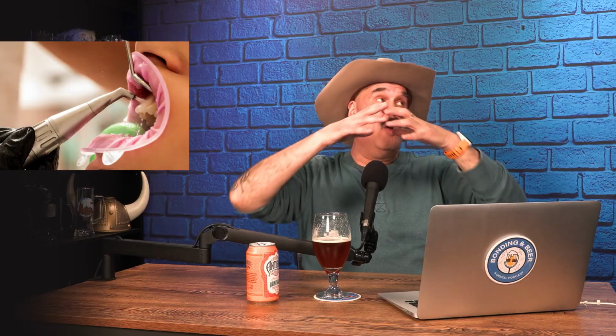This is just for sandblasting. If you add water to it, now we're talking about doing intraoral sandblasting, which opens up such a way more opportunities. But when it comes to bonding, just a regular sandblaster, one of those micro etchers, that will do the trick. Something to think about. We're going to wrap it up.